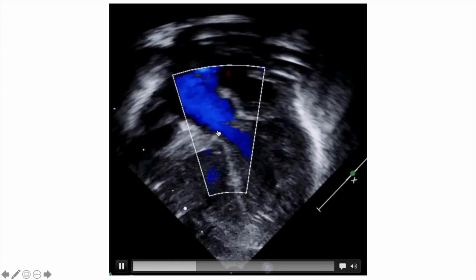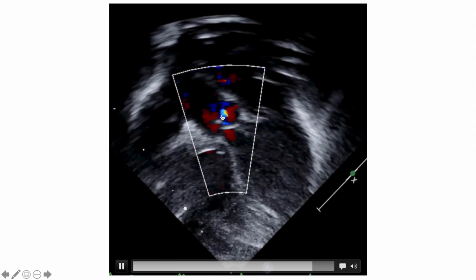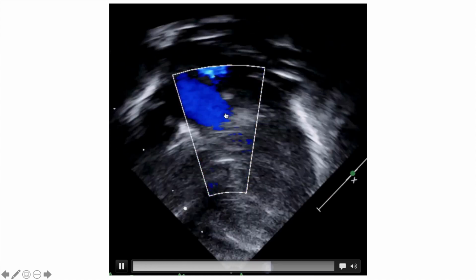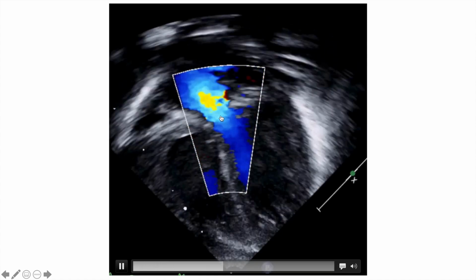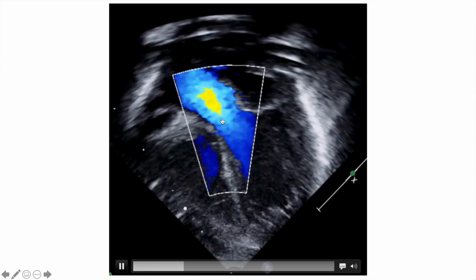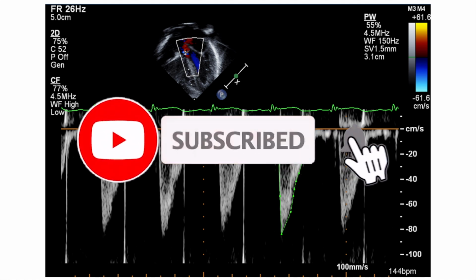And then all we need to do is Doppler the flow here at the aortic valve level. In pediatrics and adult, they probably check it within 0.5 to 1 centimeter below the valve, but in the TNE world, we have to get it at the valve level exactly. We get the VTI, we trace it, we calculate it, and then we apply it into the equation and we come up with the LV output, as we saw in the equation earlier.